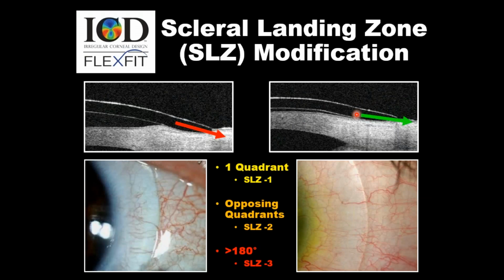Now, the last area that tends to be a bit of an Achilles heel for scleral lenses, in addition to the fogging, is the landing. Getting that angle right is only observable after settling. So here we have a lens, and you can see its angle coming into the surface. Clearly the underlying angle of the sclera is much flatter than the angle of this lens, resulting in a steep fitting relationship and will most likely create the blanching that you see here.